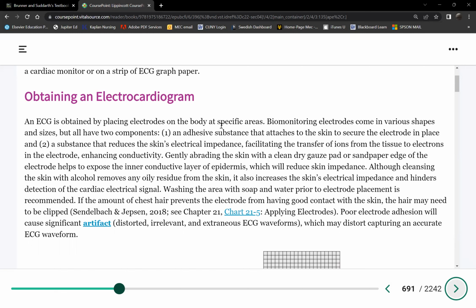In a 12 lead, there are 2 meanings to the word lead. When we say lead, we are, of course, referring to the cardiac electrodes that we put on the patient's body. However, in the 12-lead ECG, the lead there is really referring to view. Lead can mean the physical electrode that you put on the patient's body, and it also refers to the views that the 10 electrodes will give you.